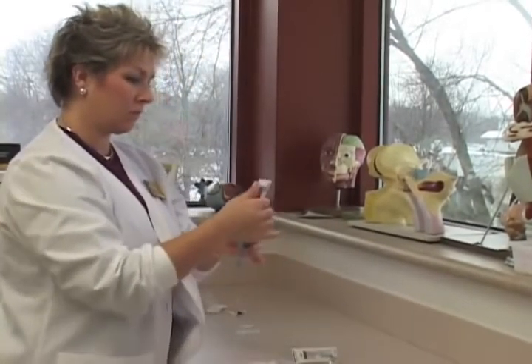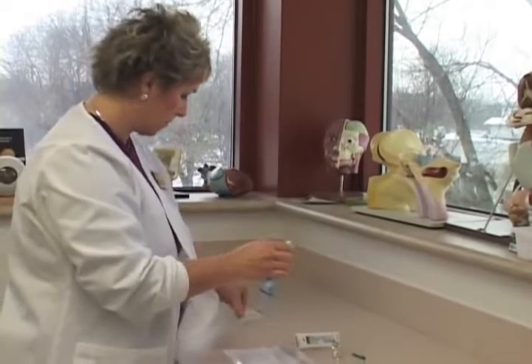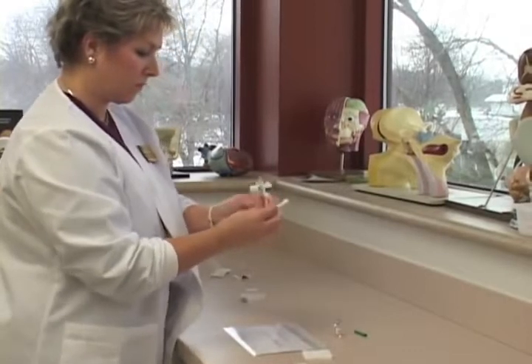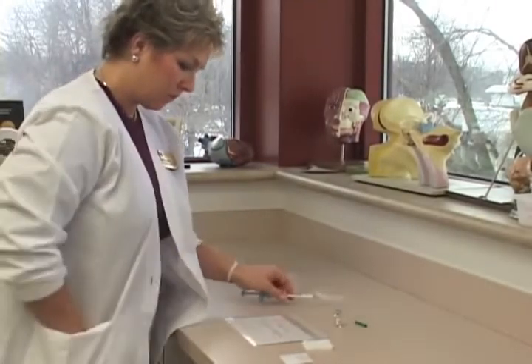Change the needle using aseptic technique. This ensures that no medication is in or on the needle, which may irritate the tissues when inserting the needle. Label the syringe.